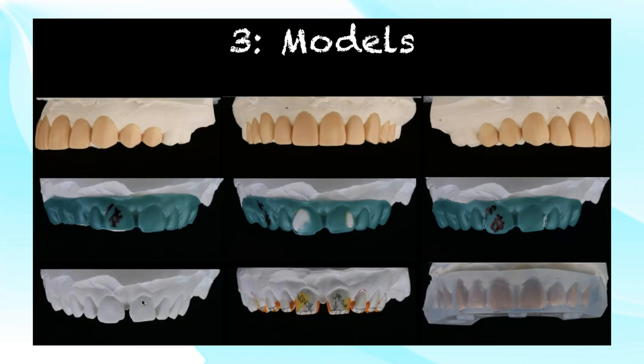So what we want to have is this wax up. And with this, we have the exact dimensions that we're going to need. We're going to have the exact reduction that's going to be needed. And this is definitely something that we have to show our patients. We have to show them, you know what, this is how much reduction we're actually going to do. So very, very little reduction.